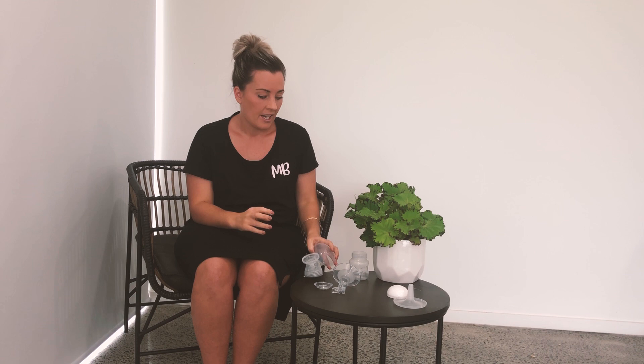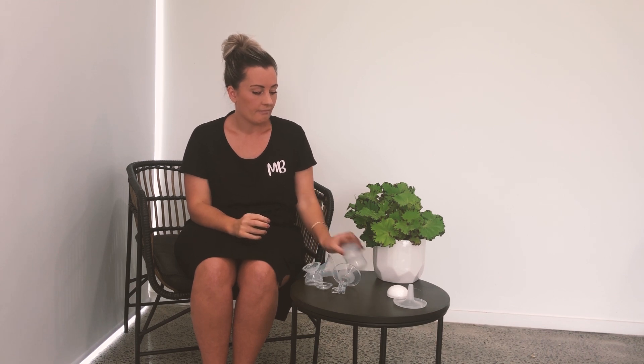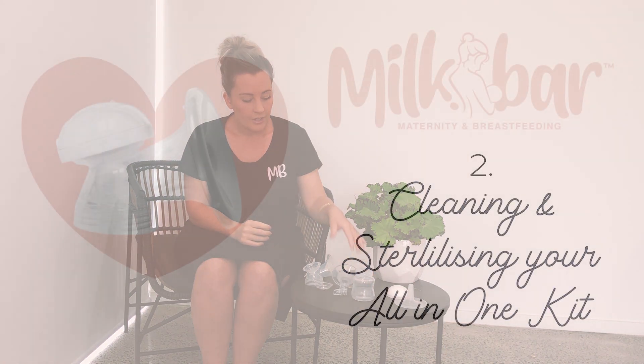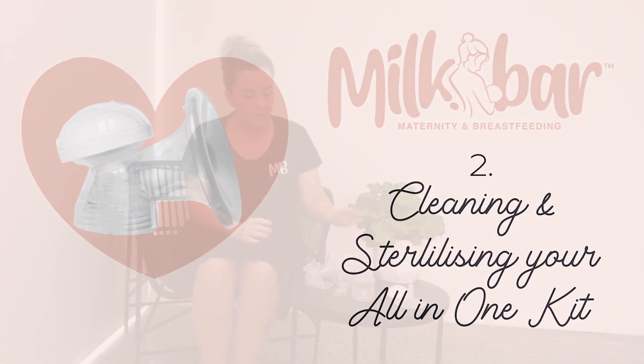All of that gets washed and you'll see your casing — this can be washed too. The little bottle as well can obviously be washed. Take the four pieces that need to be washed and wash them with a little bottle brush and hot soapy water. You can use the smaller brushes to wash down into the little valve.